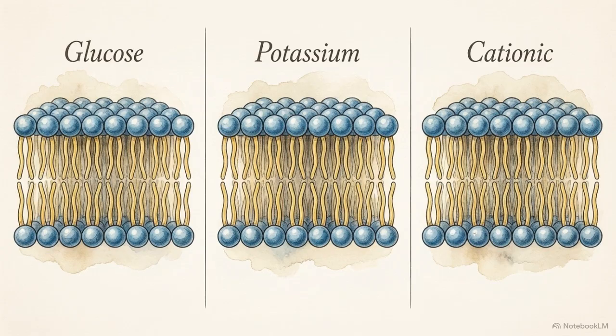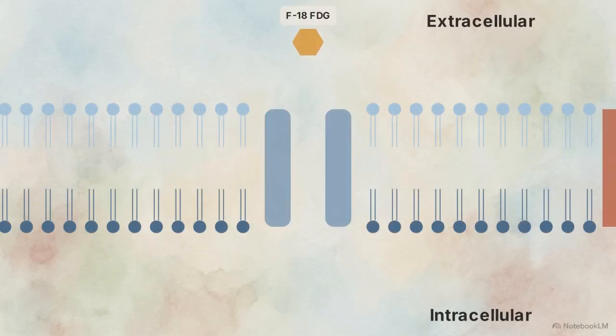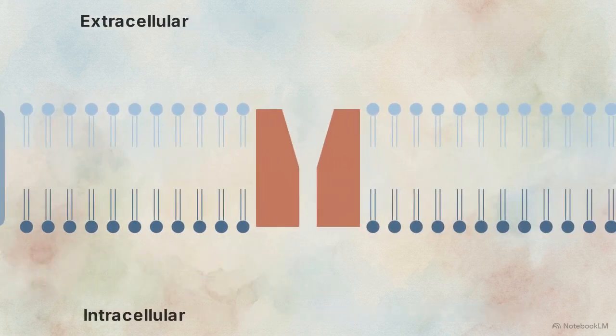This split-screen schematic isolates 3 specific diagnostic scans that bypass complex anatomy entirely, relying on 3 pure cellular transport profiles. Fluorine-18 FDG is a glucose analog. It enters the cell through facilitated diffusion and is permanently trapped via phosphorylation. Thallium-201 functions strictly as a potassium analog.